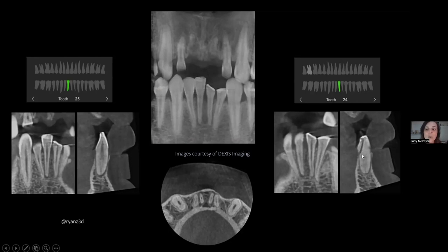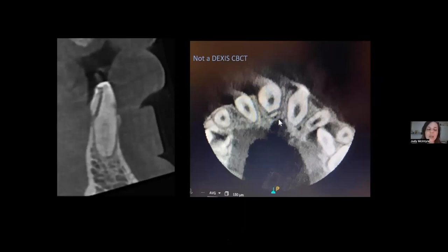Whereas if it were more obliquely fractured, I might be involving the periodontist. I might be involving the oral surgeon. I might be involving the orthodontist to super-erupt the tooth so that we can get restoratively below the fractured segment. So all of this is helpful only with 3D imaging. And that is why I so very much value it on nearly all of my patients, especially on trauma patients too.